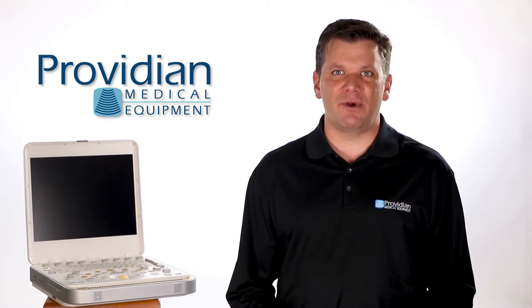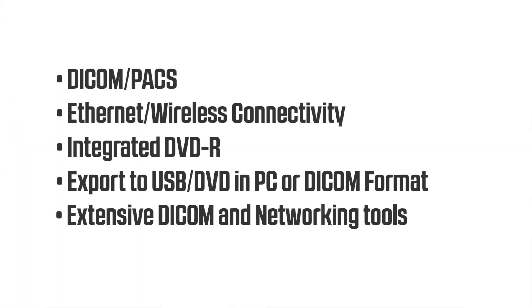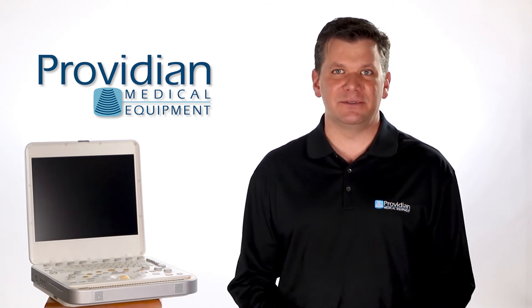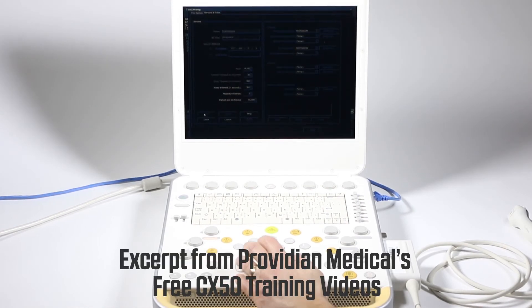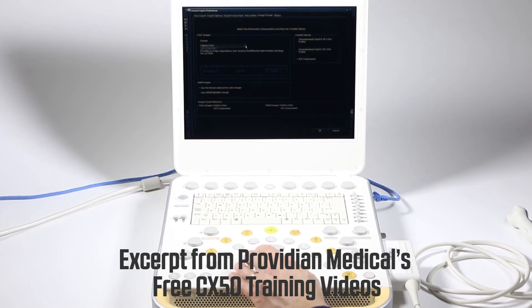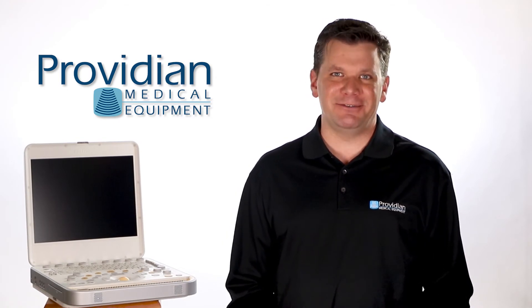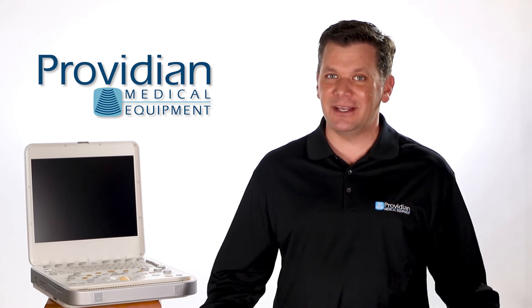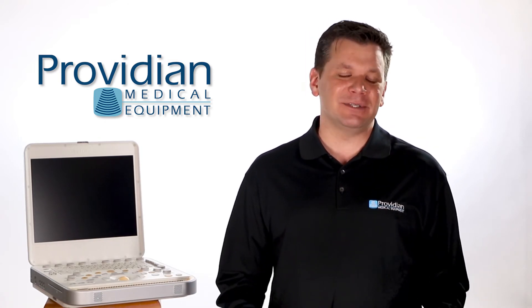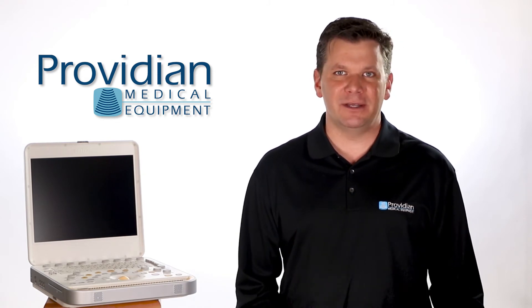Exporting and connectivity features rank at the top of the category with so many options compared to other machines. In addition to its extensive DICOM and PACS features, you can export to USB or the integrated DVD burner to PC or DICOM format. The CX50 is also one of the most customizable systems on the market and it's designed with the user in mind. There are some things in the system setup that are much more user friendly than any other system out there — specifically its explanations of different critical technologies that most users just don't understand. These can be very helpful in making you more efficient. Philips seems to be the only manufacturer that recognizes that ultrasound techs and physicians generally don't understand image compression, DICOM networks, and complex system setups. While the Philips is still complex, it does have helpful tools about its more complicated features that don't require deep research or a degree in information technology or biomedical engineering.